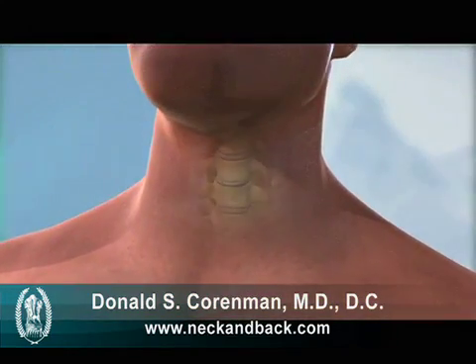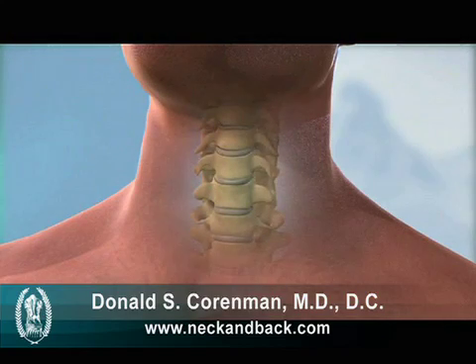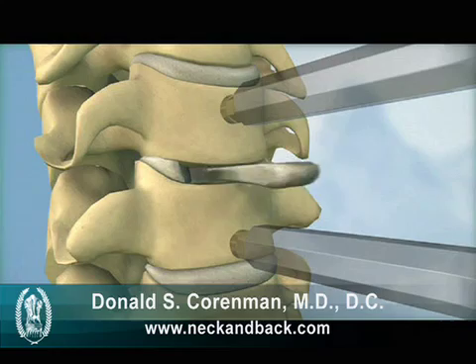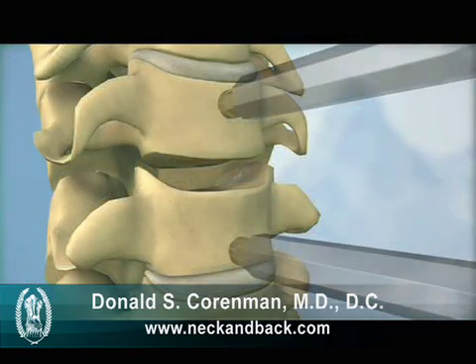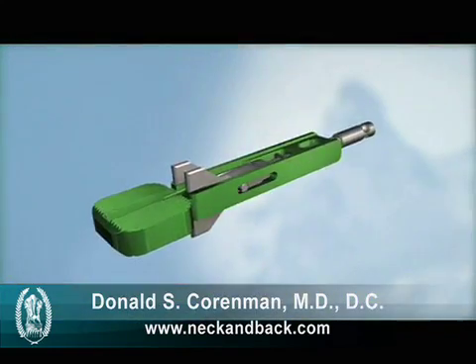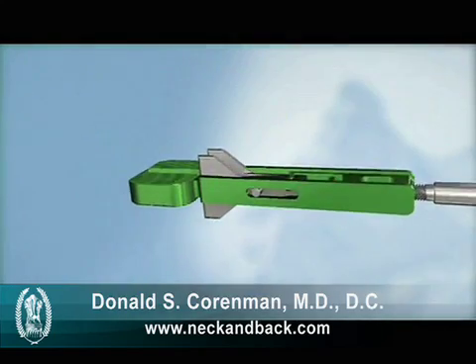First, an incision is made in the neck at the location of the diseased disc and the soft tissues are moved away from the front of the diseased disc. The surgeon then performs a discectomy and remobilization, removing the diseased disc and releasing pressure on the surrounding nerves and spinal cord. Once the disc space is cleared and the segment is remobilized, a trial is used to assess the implant size and position within the disc space.